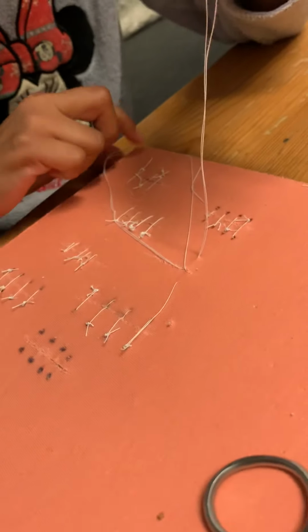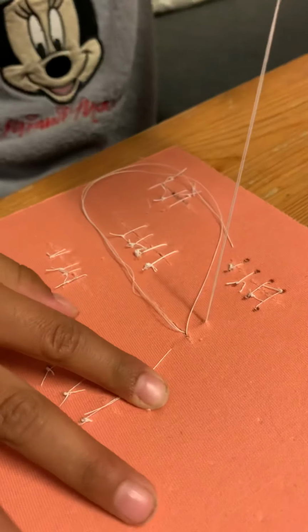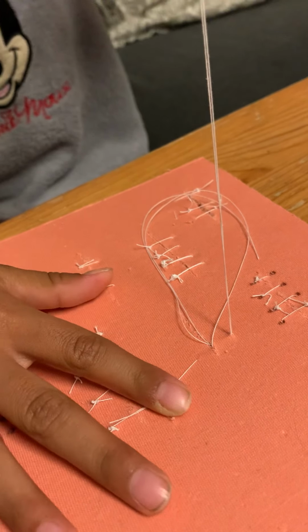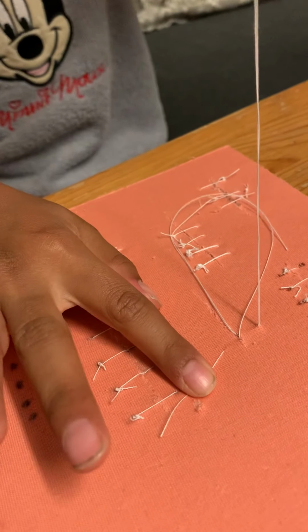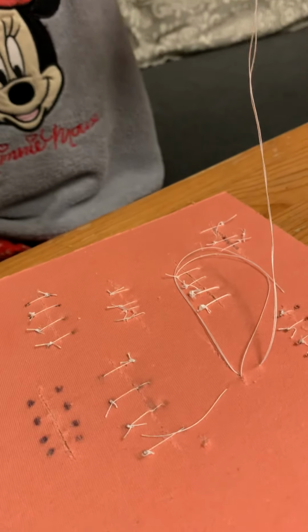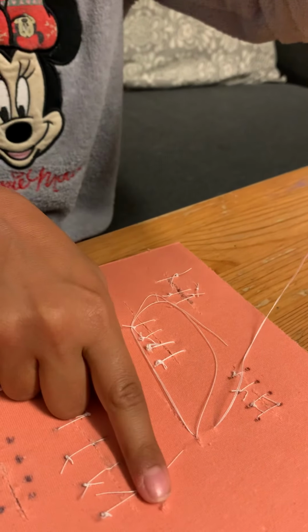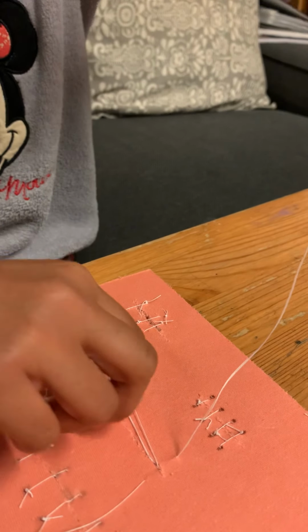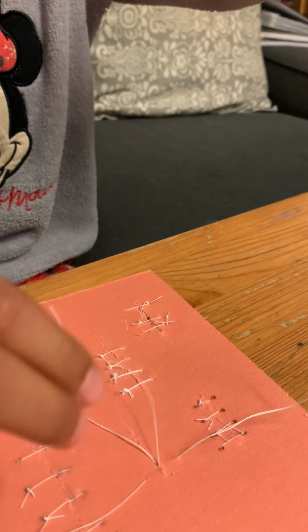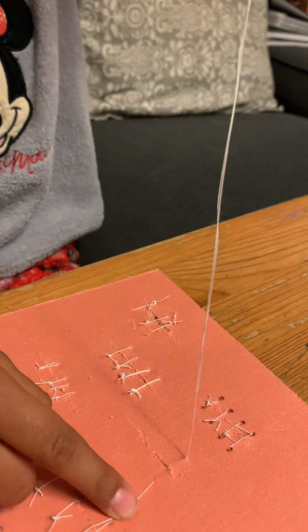And in case it goes on the edge of the foam, or whatever you're using to practice on, or if you're on a real human, it won't harm, but I'm practicing on paper, on foam, so you put your finger on that small line, which we showed before, and then we go through all of these loops.